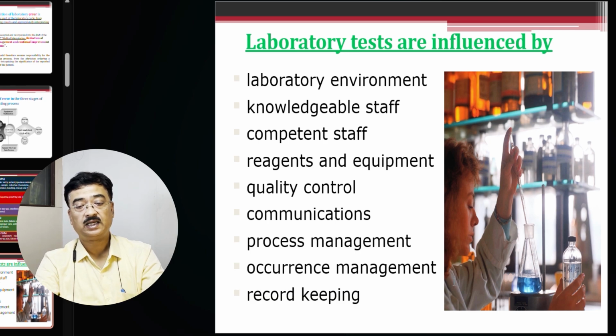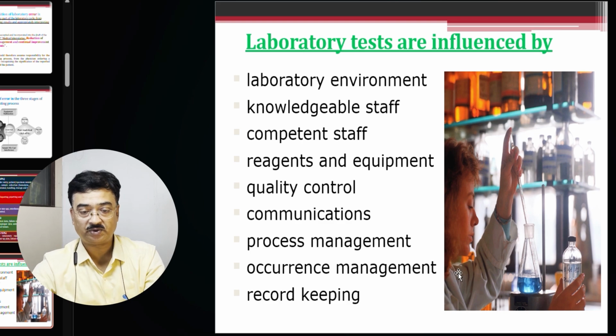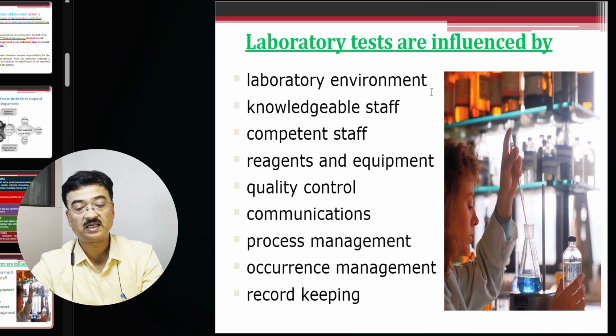Therefore, when you are working in a laboratory, the tests are influenced by the laboratory environment for sure. Then knowledgeable staff is very important, to have competent, knowledgeable staff.